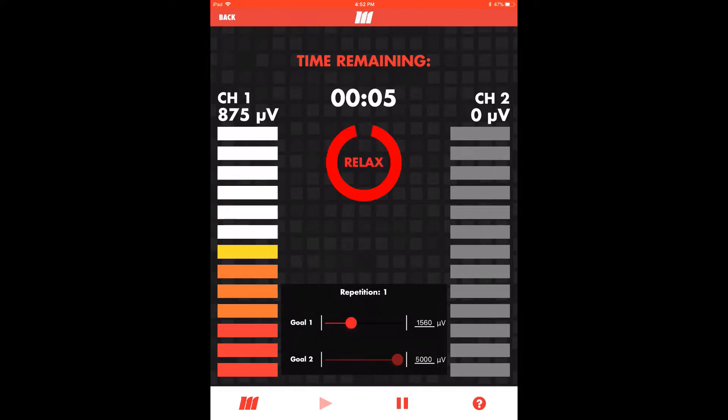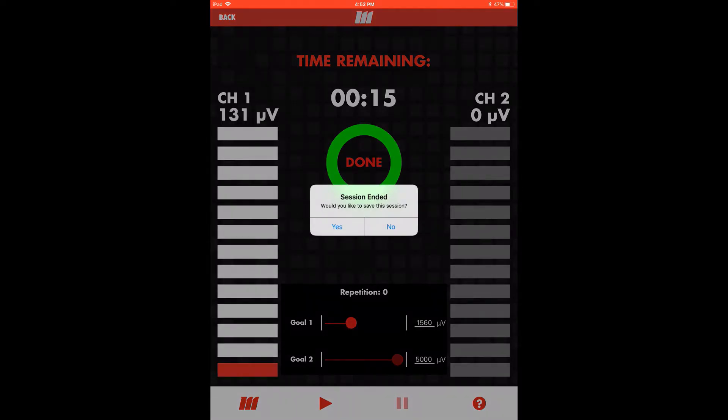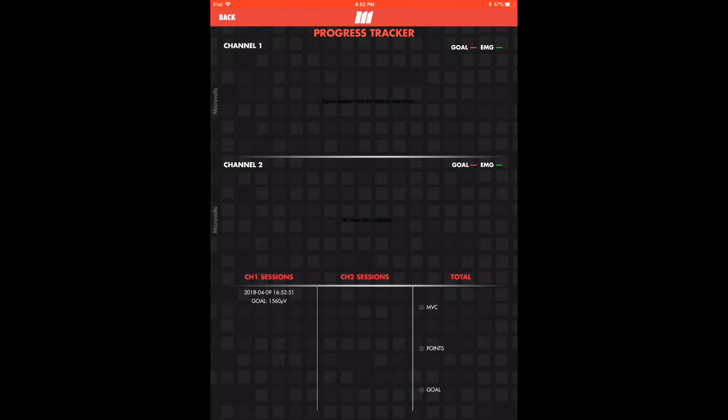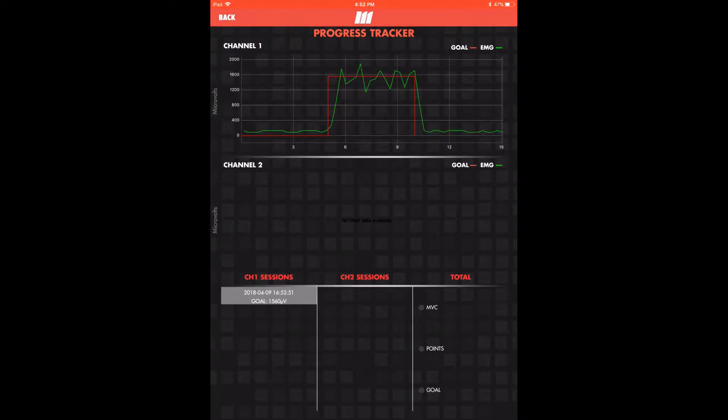When the session is complete, select Yes to save session output to the tracking module, where we'll head next. Tap the session timestamp to see a graph of actual output, the green line, compared to the goal, the red line.